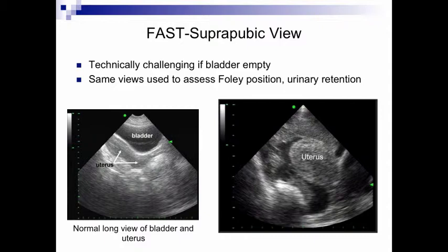But if you have the bladder as an acoustic window and there's urine within, it's going to be probably more sensitive than looking at Morrison's pouch.